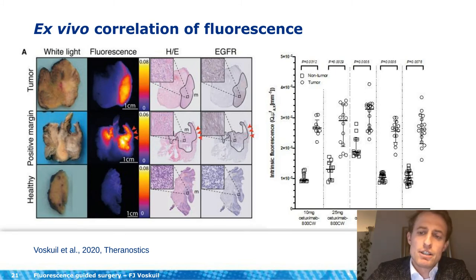thereby limiting the chance of side effects and the exposure of the drug. And on the left-hand side, you again see here a very nice correlation between the tumor and the fluorescence, and it correlates to the H&E slide and the EGFR slide as well.